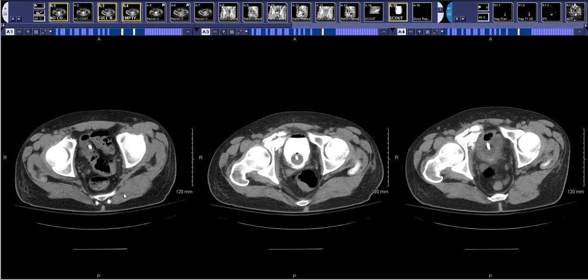For children, people use the toe curl rule. So if you're watching a kid and their toes start to wiggle and curl, that's about the time when you can stop. Obviously, we don't want anybody to be in pain or cry, so if you can't make it to 100 or 150 and the patient can't tolerate it, just stop. But get as much in as you can.